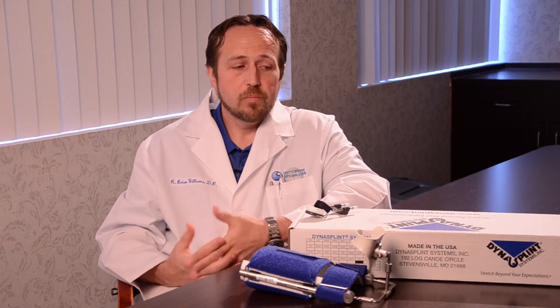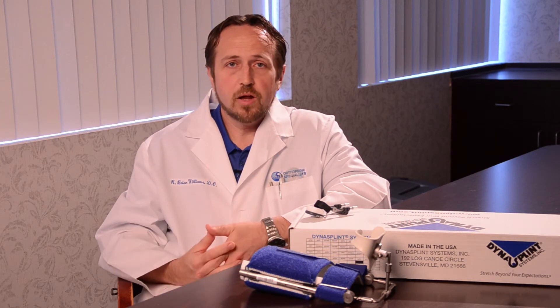I would wholeheartedly recommend the use of one of these dynamic splinting apparatuses following the manipulation of a Dupuytren's. I have used the Dynasplint product exclusively.